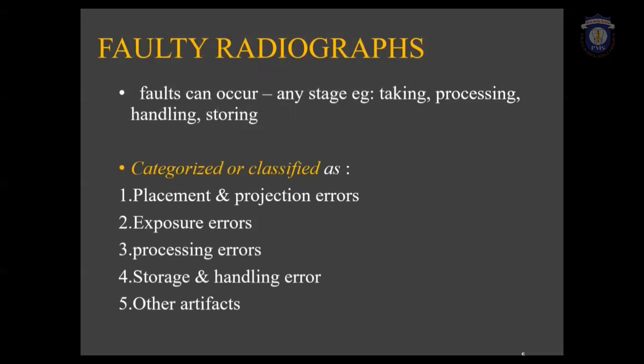What are the causes of a faulty radiograph? The faults that cause a faulty radiograph can occur at any stage. For example, while taking the radiograph or during processing, handling, and storage, all these can cause a faulty radiograph.